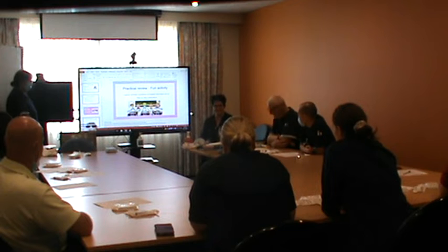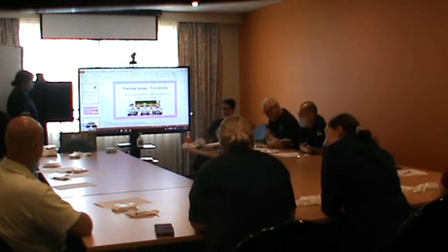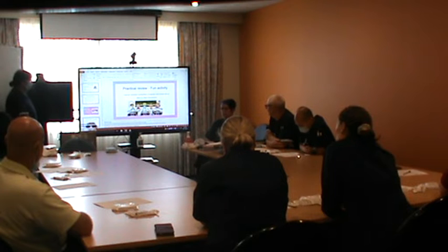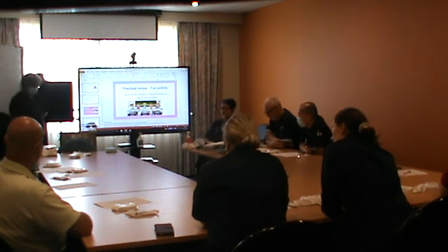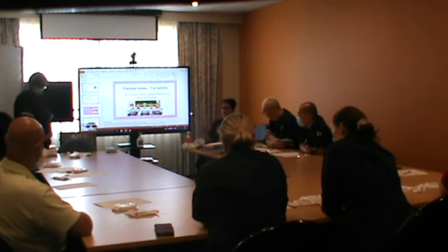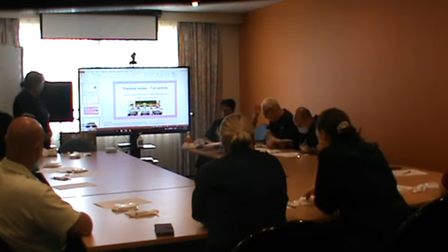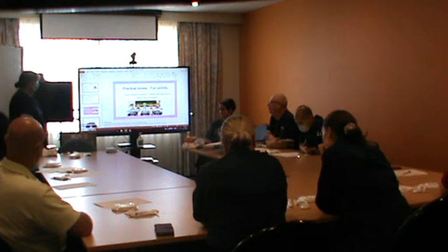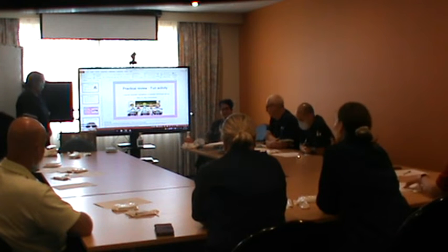The first thing I'm going to start with, number one, is we're going to perform the risk assessment and identify what type of aseptic field we're going to require. We want a cannula, which requires aseptic technique, so we've decided that we want the aseptic field. The second step is to review the procedure. Do we need to do the procedure? Yes, we do. Next.